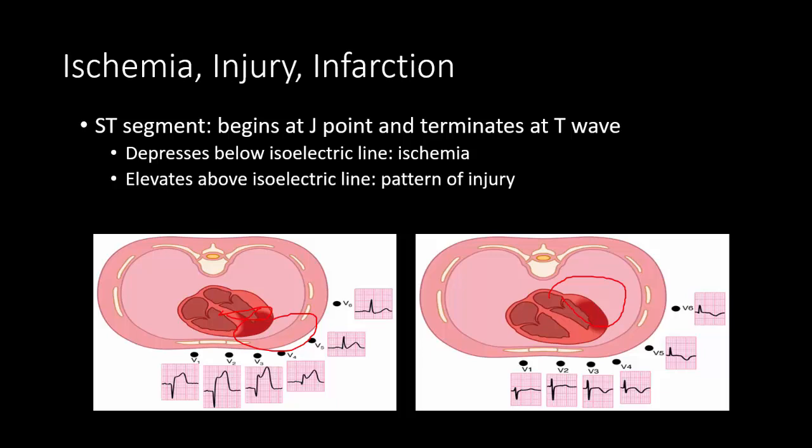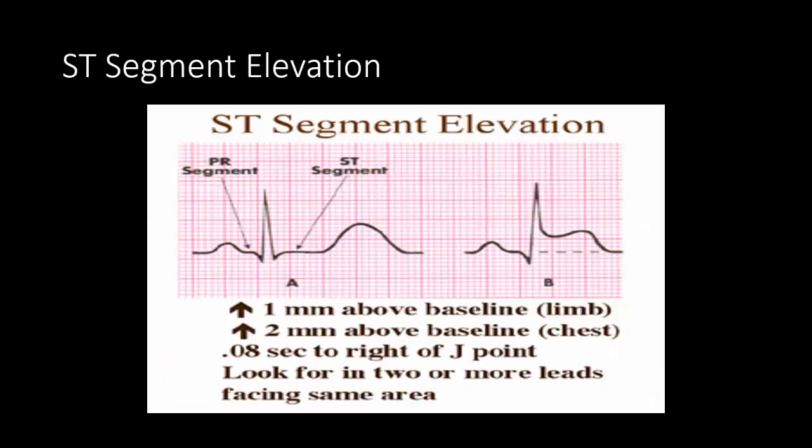Just another graphic here with ST segment elevation. In your baseline or your limb leads, you're looking at least 1 millimeter above the baseline, and then in your chest leads, at least 2 millimeters above the baseline.